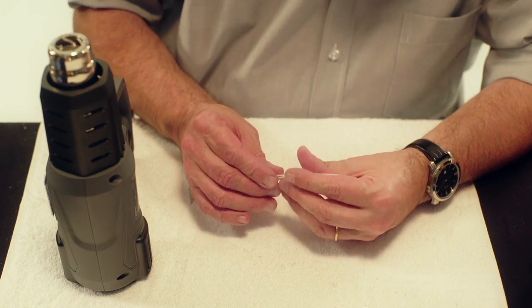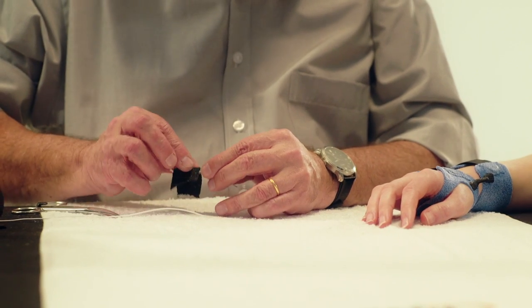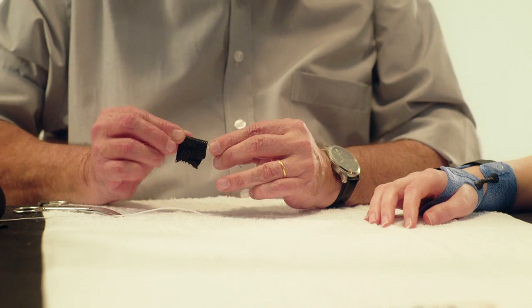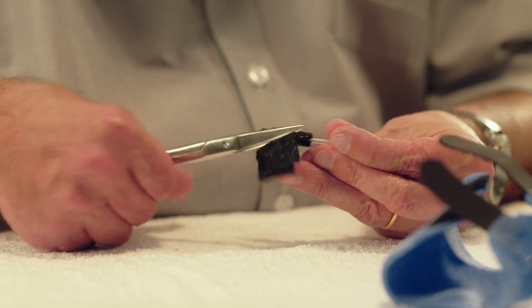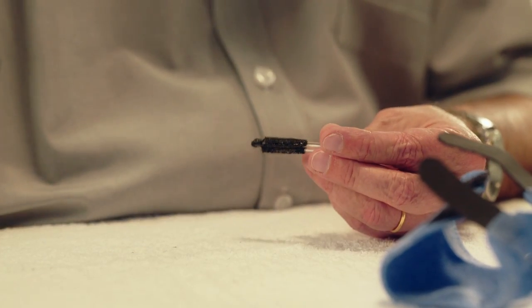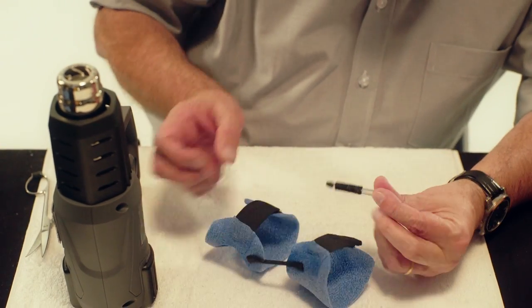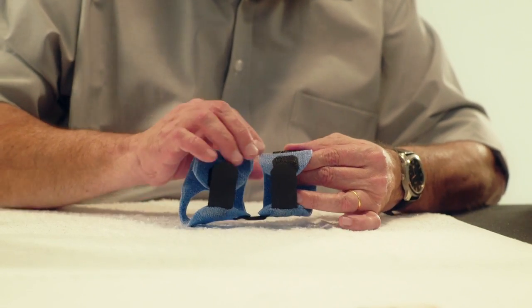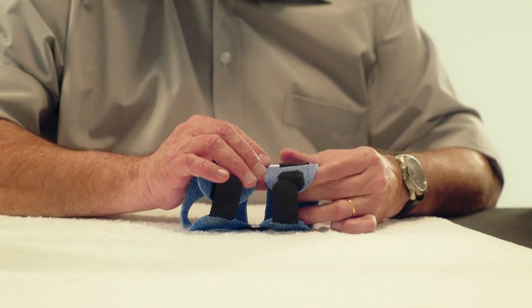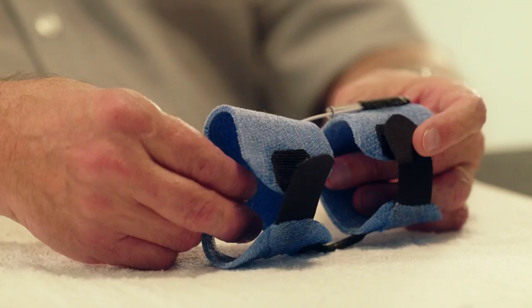Pass the elastic thread through the Orphi tube. Heat a small strip of Orphicast and wrap the Orphi tube with the Orphicast. Cut away any of the excess material. Heat the Orphicast on the Orphi tube with a heat gun and heat both portions of the orthosis on the ulnar surface. Stick the Orphi tube onto the proximal ulnar side of the orthosis.